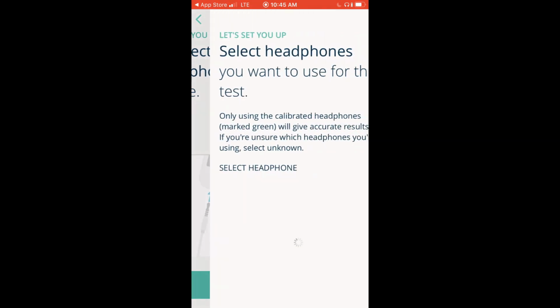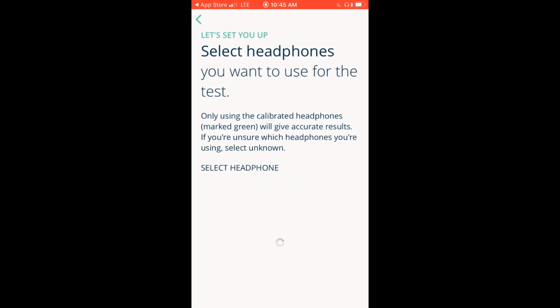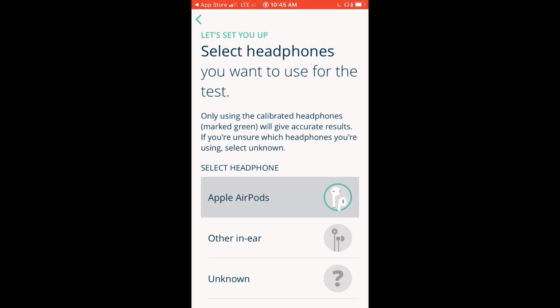And now it wants to know what kind of headphones you plugged in. You can have in-ear, over-the-ear, on the ear. If you don't know, you can click that, but this will help it calibrate. I'm going to select in-ear. You can see there's a green ring around the Apple AirPods. That means it's calibrated to those Apple AirPods, so you can use that. If it's something else, that's okay. Just select what you have.